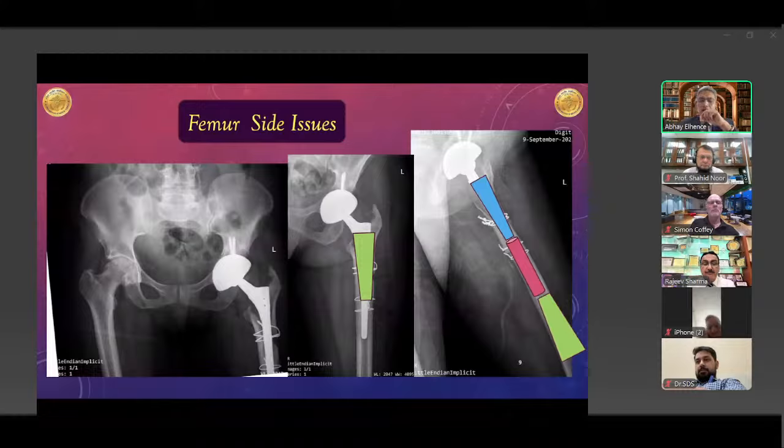What we're essentially trying to discuss is that we need to marry our stem geometry, for all types of stem, towards the quality of bone, the amount of bone defect, and where exactly we are looking to get our fixation in the femur. So if you see the proximal femur, it is a cone. As you go distally starting down the isthmus, you start to have a cylindrical femur. And if you have bone loss extending way down, then you start to walk into a reverse cone.